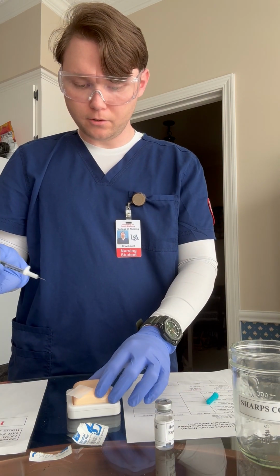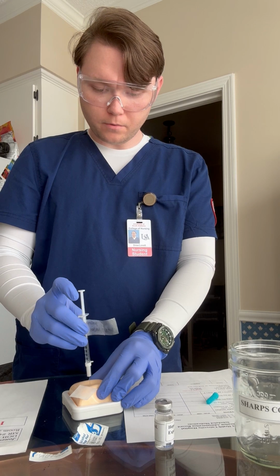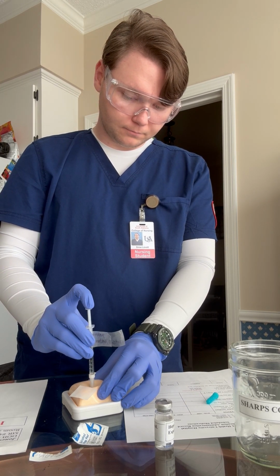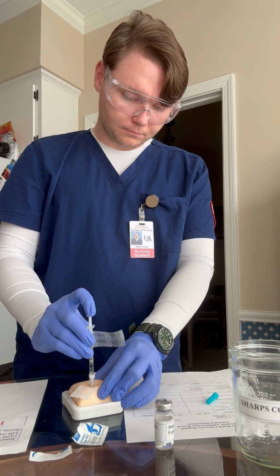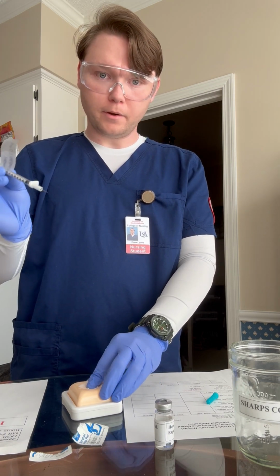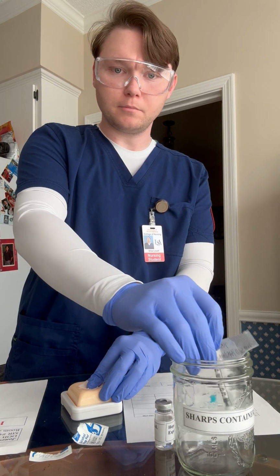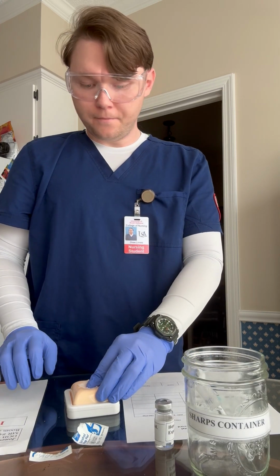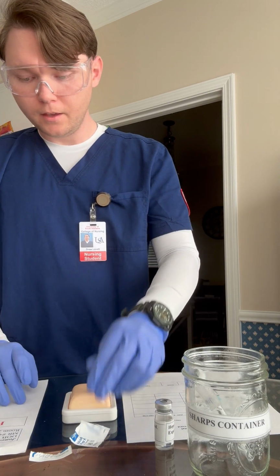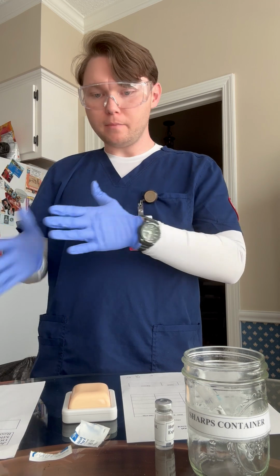All right, Mr. Jones. Little poke, 1, 2, 3. All right, and apply a little bit of pressure, and I'm going to discard this into my sharps container. All right, so now I'm going to get Mr. Jones back comfortable. I'm going to get you back in a comfortable position, get you covered back up, get that bed rail up, and I'm going to let the bed back down.